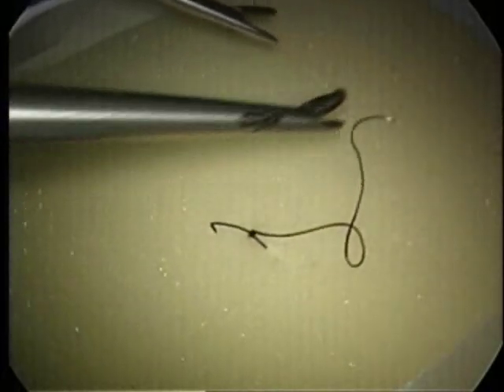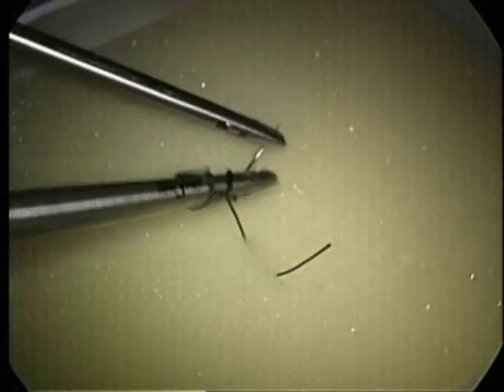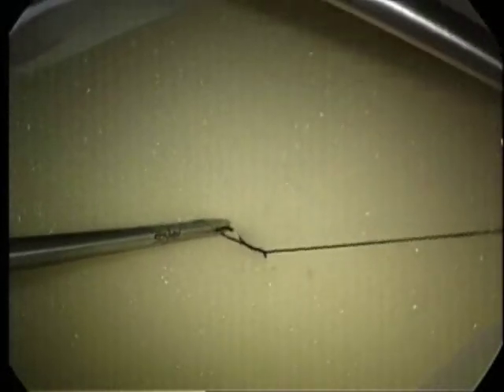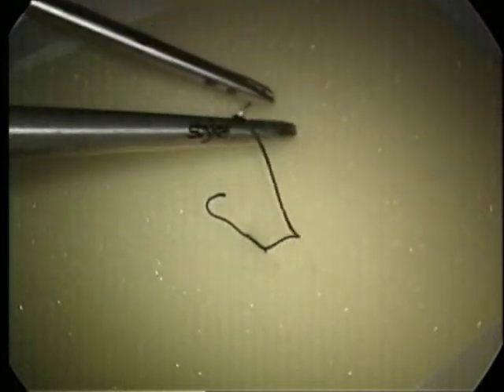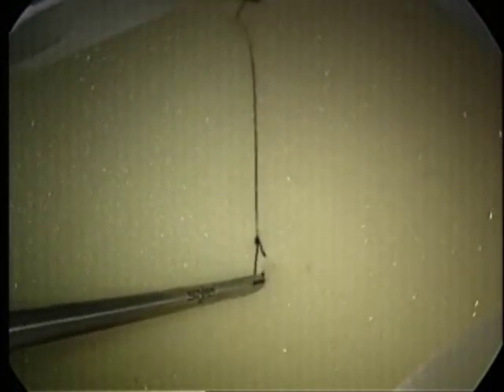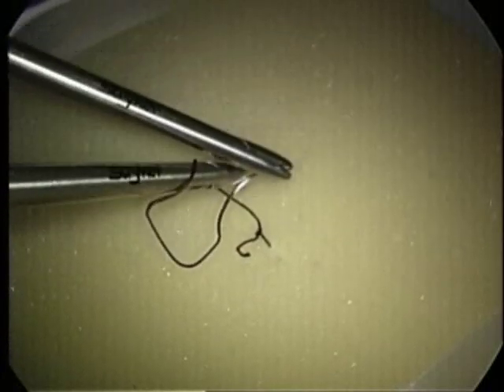The left hand then comes back to the right side of the knot and is held close to the tissue. The right hand then rotates counter-clockwise, grasping the tag of the suture. The left hand then goes to the eleven o'clock position and the right hand goes to the five o'clock position, leaving the tag at five o'clock.